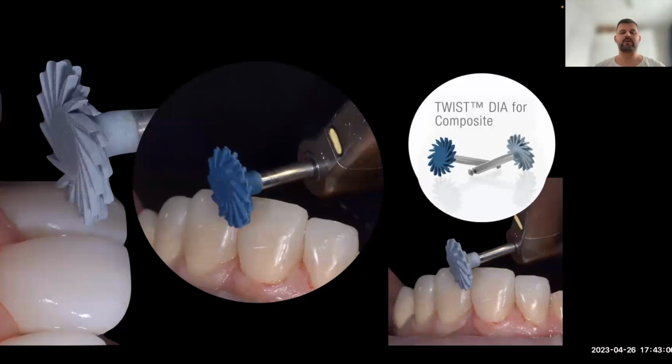Then I use this rubber brush, Twist polish composite from Kuraray. For me, this one is one of the best. I like this blue one because it's more coarse, more aggressive, and the gray one is more polished, more delicate, and you can receive a very good result using this rubber brush. And remember, without water, and we are working at a speed of about 5,000 to 10,000 RPM.